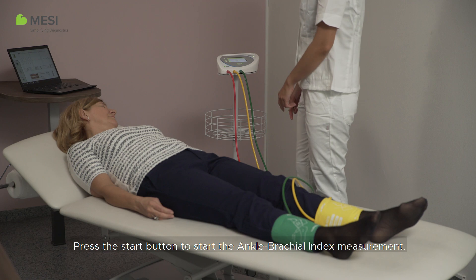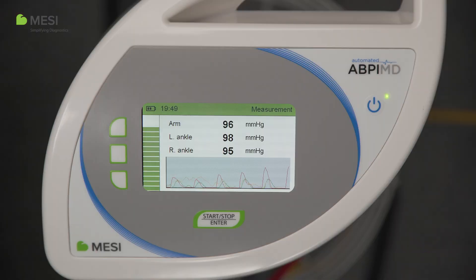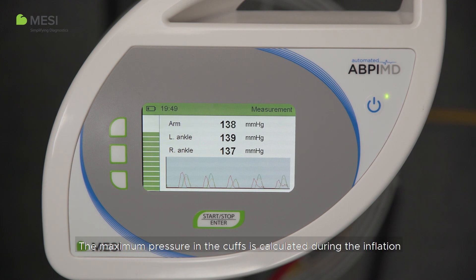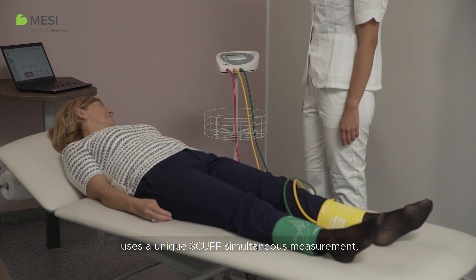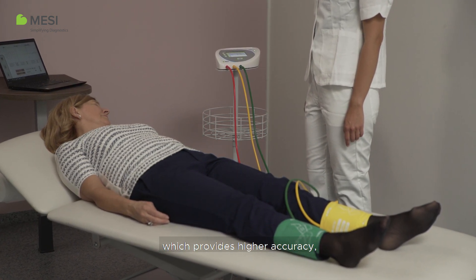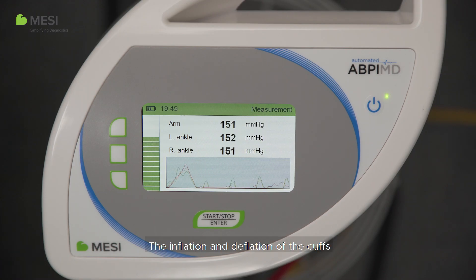Press the start button to start the ankle brachial index measurement. During the measurement, current blood pressure and pulse waves are displayed. The maximum pressure in the cuffs is calculated during the inflation and therefore varies from person to person. The MACI ABPI-MD uses a unique three-cuff simultaneous measurement which provides higher accuracy, reliability, and efficiency. The inflation and deflation of the cuffs is controlled by an algorithm.